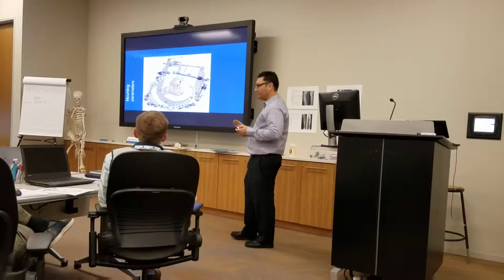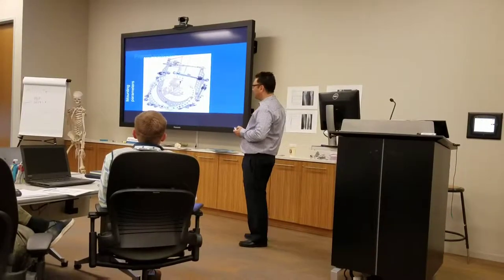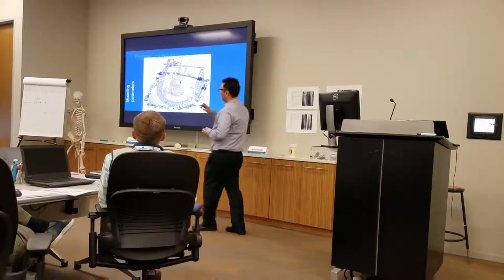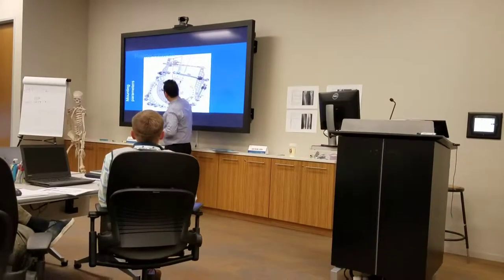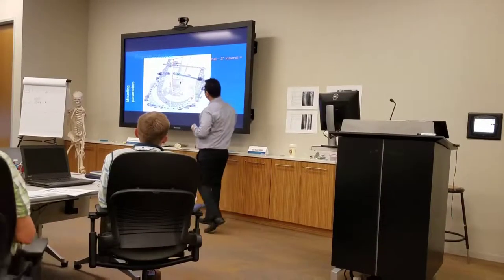Now also, very important: rotation, rotation, rotation. At the end, you always check that rotation. That's what Dr. Allah did yesterday. This is a very minor amount of rotation, but if you shoot that wire up the second metatarsal, you see that it's rotated. Here's that center of the tab, so it's rotated internal.